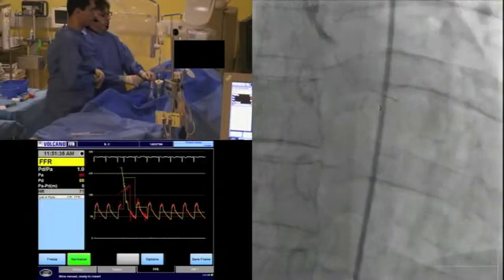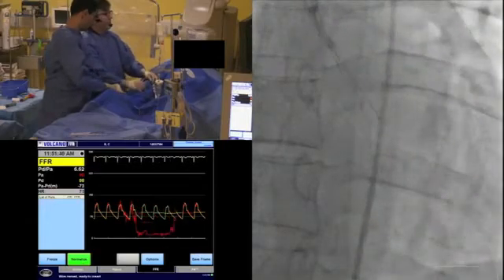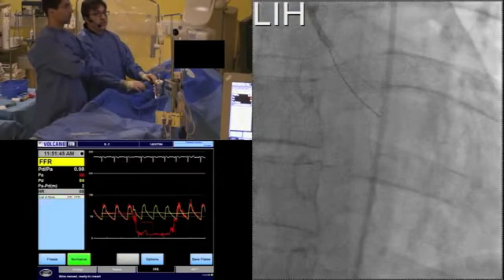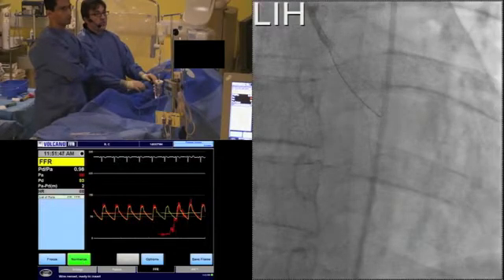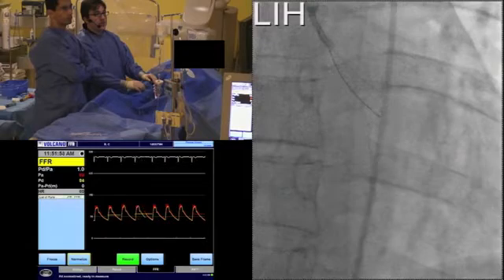So I'm just going to take the wire down. It's just free floating in the aorta. I'm going to pull the needle introducer back. Let's check our position. That is a great position. We can see that even before normalization on the screen, the curves are almost overlying one another. We know we have to normalize it. Kevin, could you go ahead and normalize for us there?